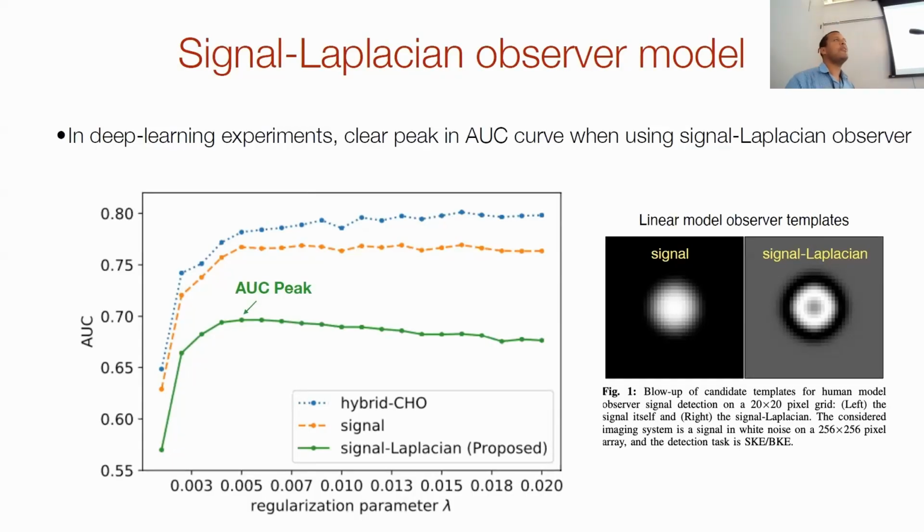I'm going to push back just a little bit on that. If you look at the edge of small and larger objects of different sizes, the Laplacian signal probably looks similar. However, we know that a much larger object will be much easier to detect than a small object if we assume the same contrast. Well, why do you say that? Just common sense.